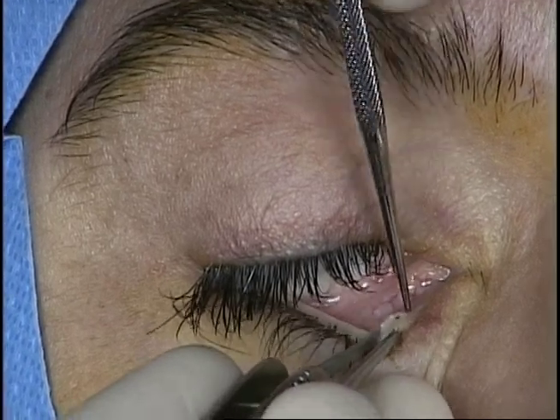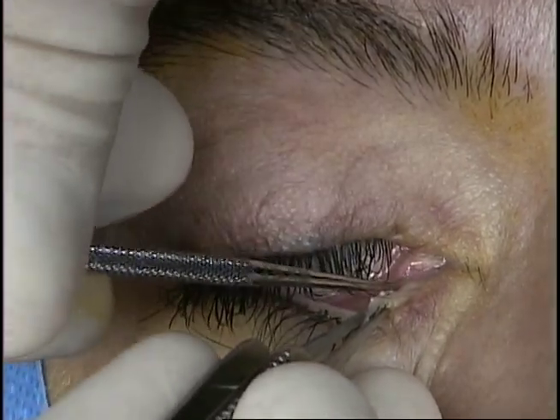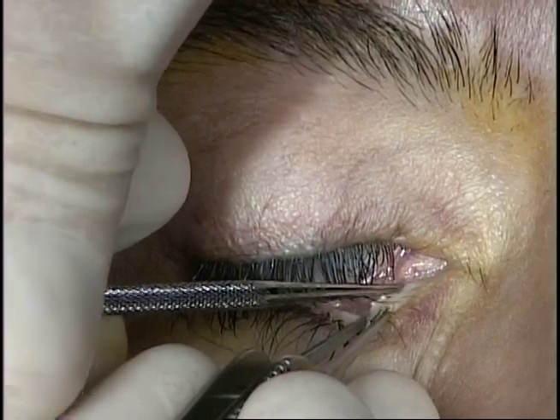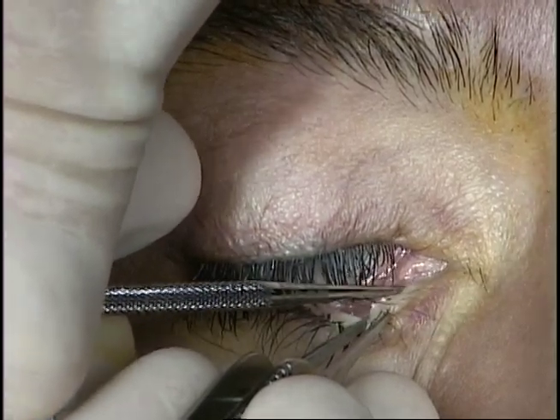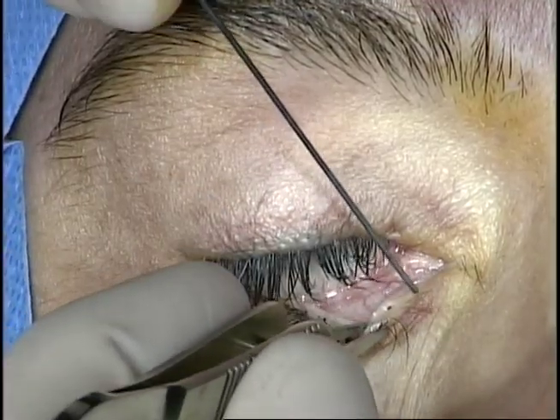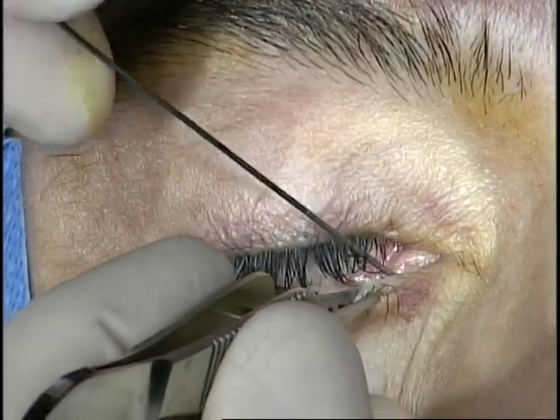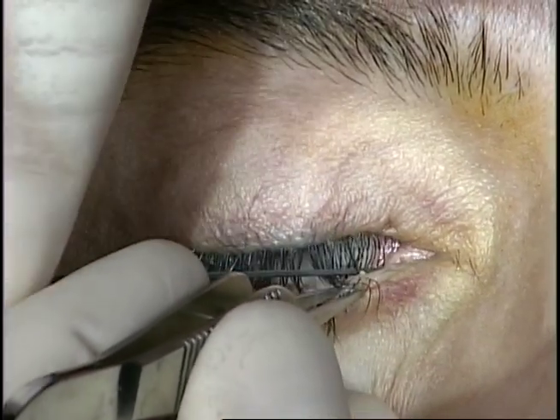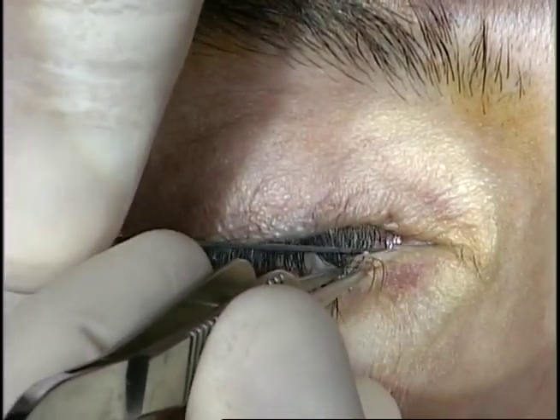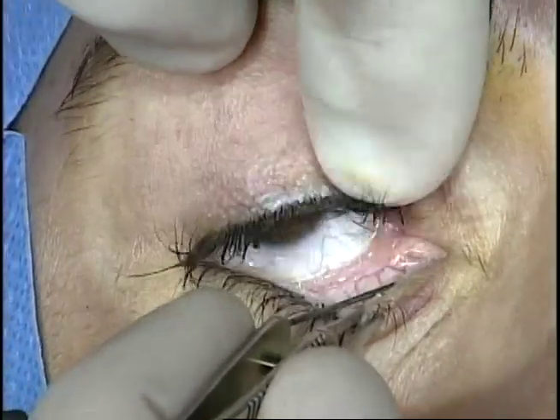A punctal dilator is introduced into the lower punctum vertically and then turned horizontally. A number one Bowman probe is then introduced in the same fashion and a hard stop is appreciated, noting no canalicular obstruction.